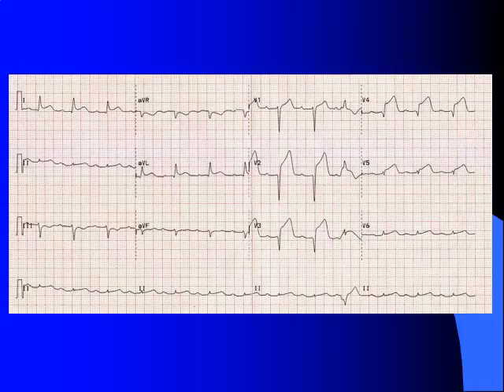Another example of a proximal LAD occlusion, this one's a little easier to pick out. We have ST elevation in V1, 2, 3, 4, 5, and 6. And then we have our reciprocal changes in leads 2, 3, and aVF, with elevation noted in lead 1 and aVL as well.